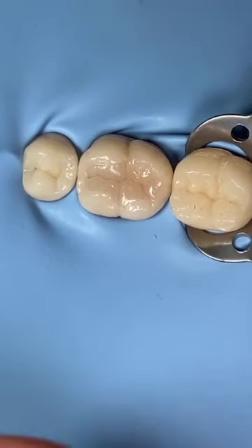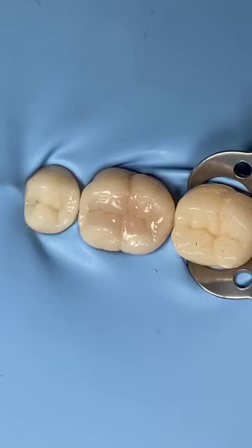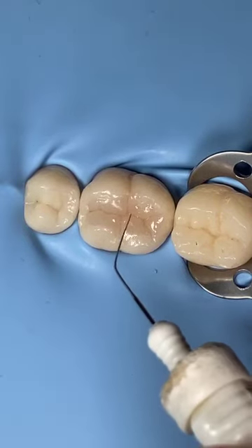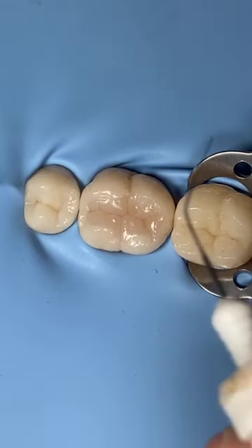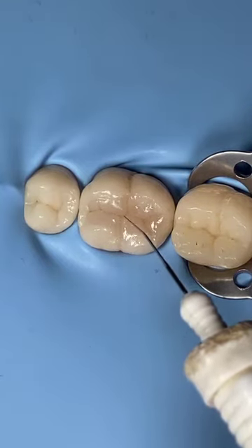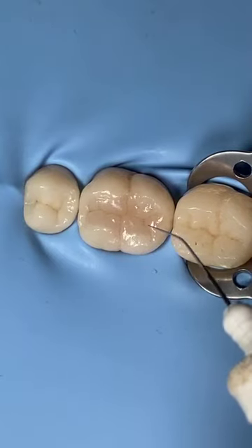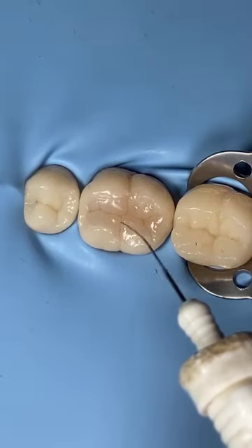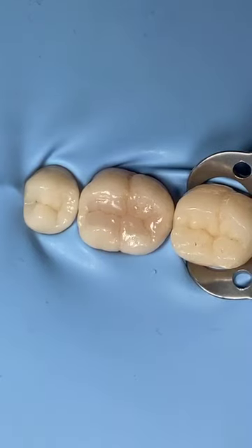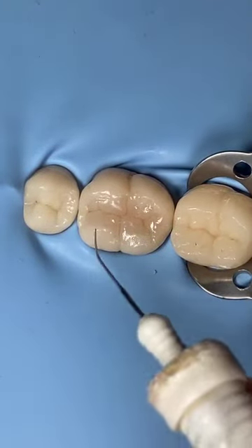This is very, very important. Because you see, it will create a little bit of gaps here. I'm afraid that if you just leave it, maybe in the follow-up there will be a micro food impaction there, and the patient will slightly feel uncomfortable. So make sure that you close all the gaps that you already created with a stain. Or yeah, I have another good way to place it.